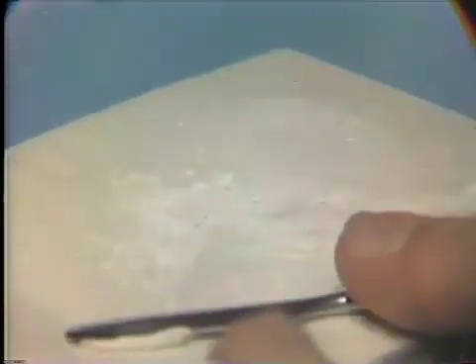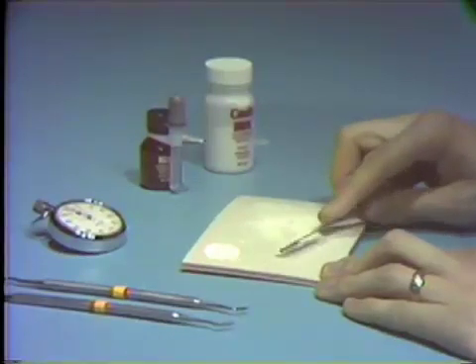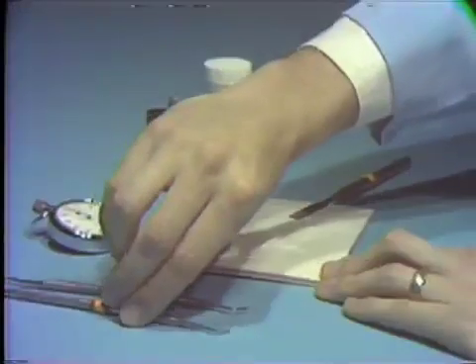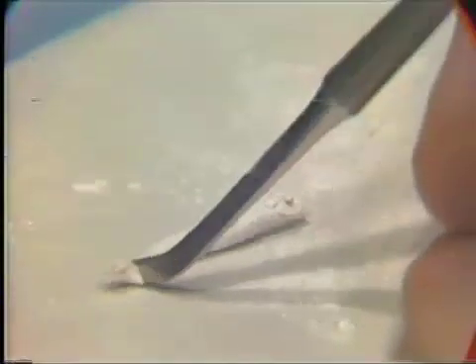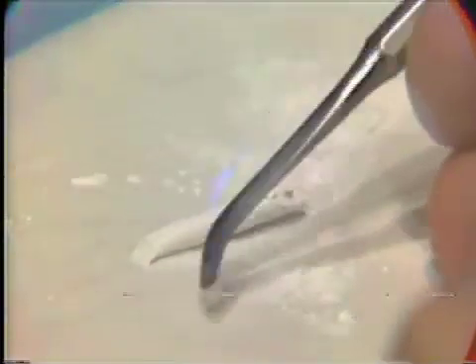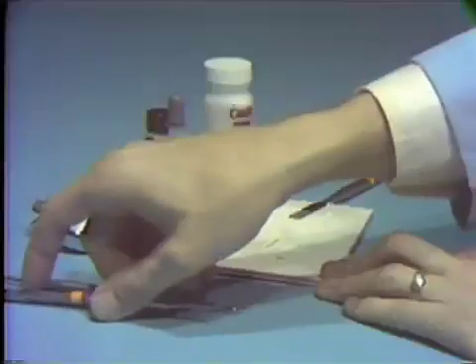The spatula is then cleaned and dipped in powder, and used to roll the material into a rope from which it can be cut into appropriate sections ready for application directly to the cavity preparation. The application is made using either the Tarnow No. 1 (SP1) instrument, with contouring of the material using the Wesco No. 25 plugger (CD7).